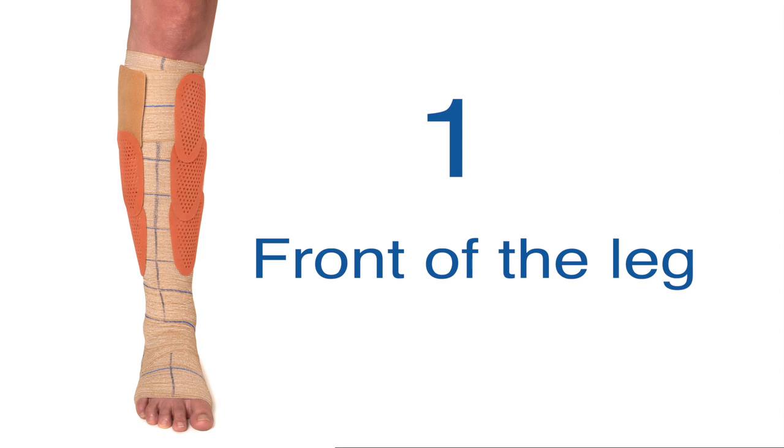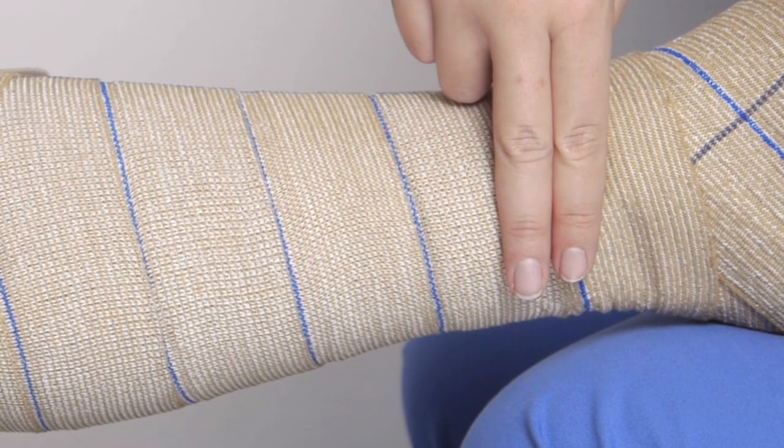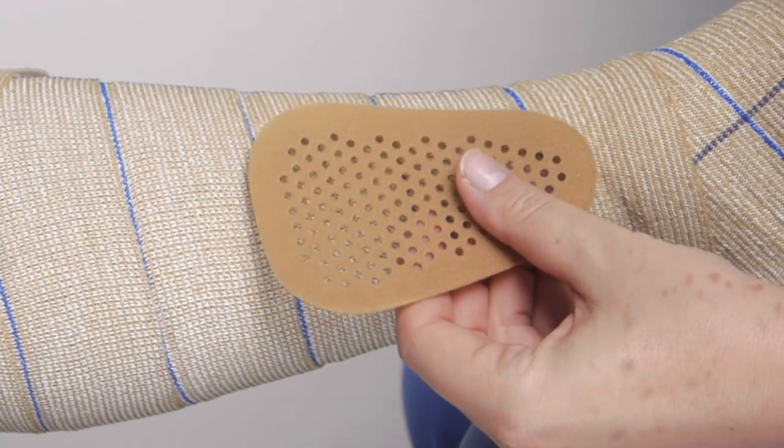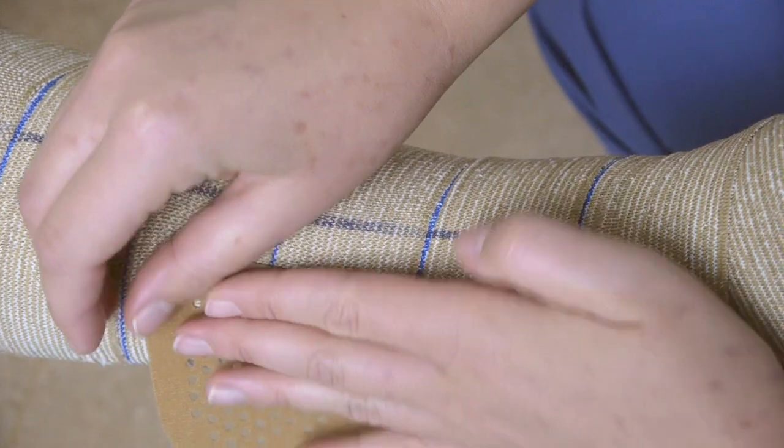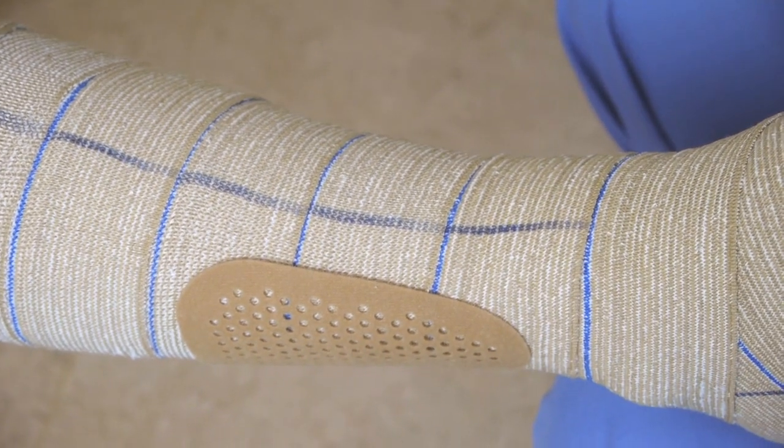Start by placing the patches along the shin, leaving a space on both sides of the crossline for the fixed patch. Place the patches about 2 finger widths above the ankle bone, and leave a 5cm gap along the shin so that the bandage crosslines are left visible.